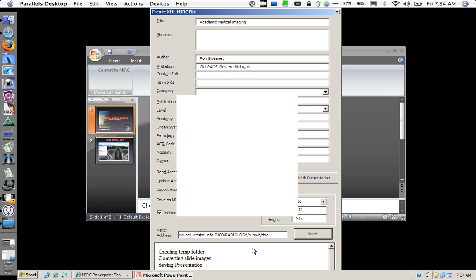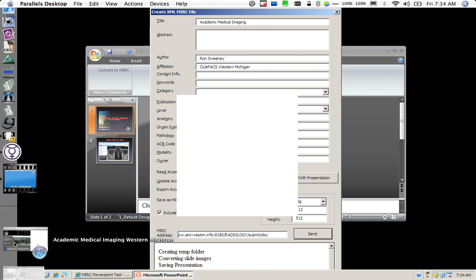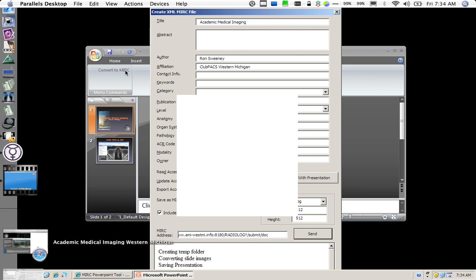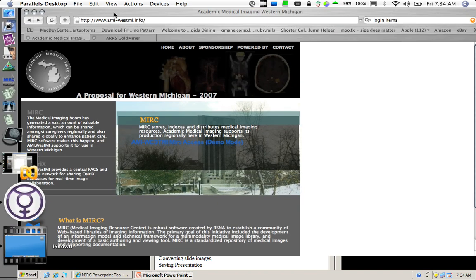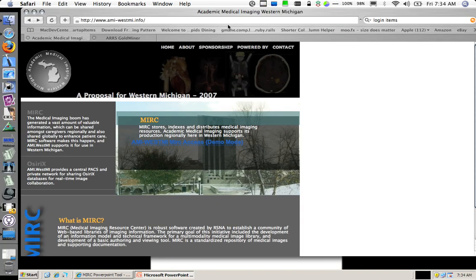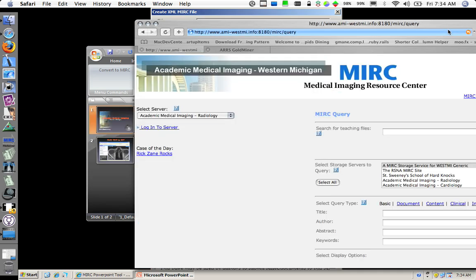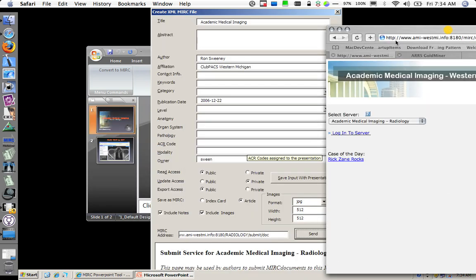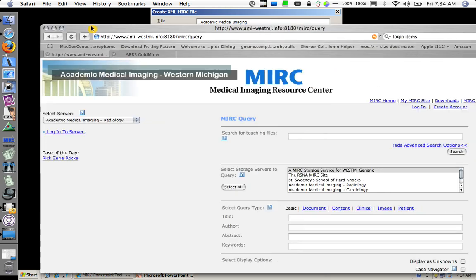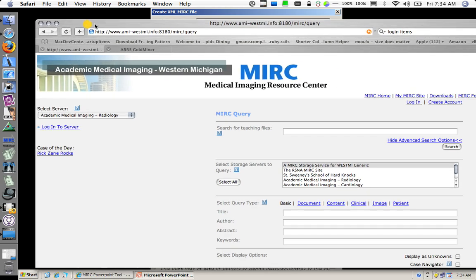I will navigate to my MIRC site. Get me in position to query for this particular PowerPoint presentation. I have confirmation down here that it was successful. So I want to go to my MIRC site and say, oh well really was it?